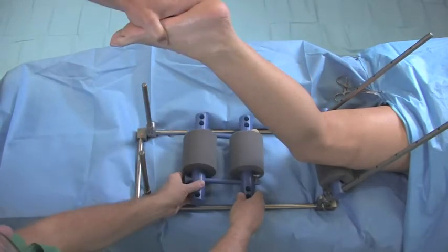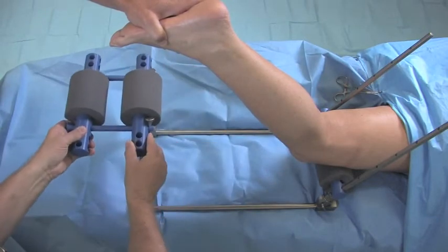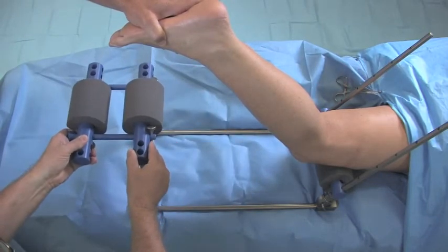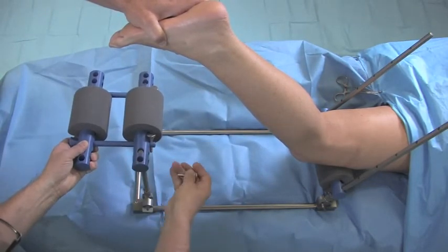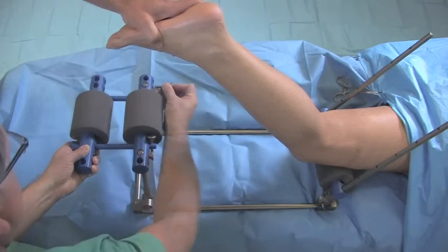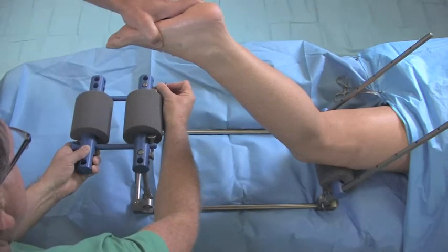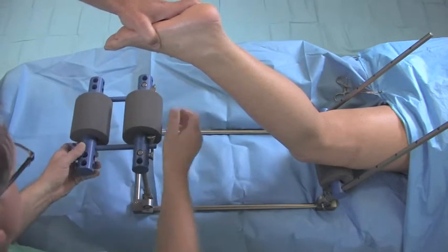Reattach the platform. This time, I'm going to use the top hole position of the short bar. Lock the assembly with the metal T's inserted into the blue T's.